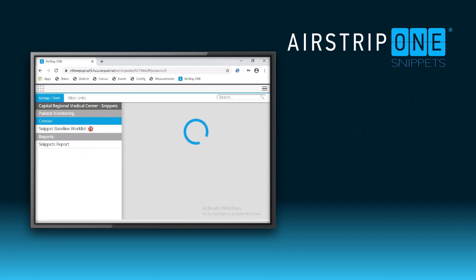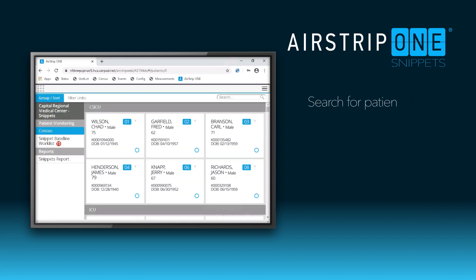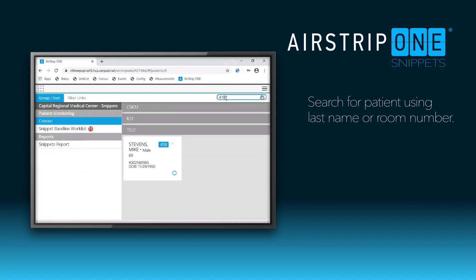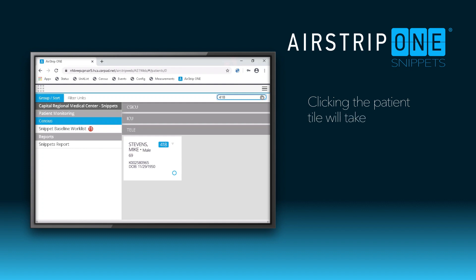Once you log in, you will see the default census page. You can find your patient by scrolling or searching by last name or room number. Once your patient is found, click the patient tile to load the summary screen.